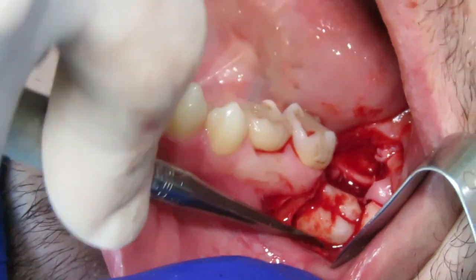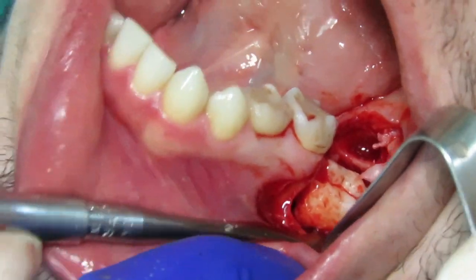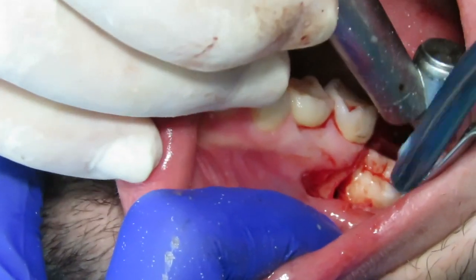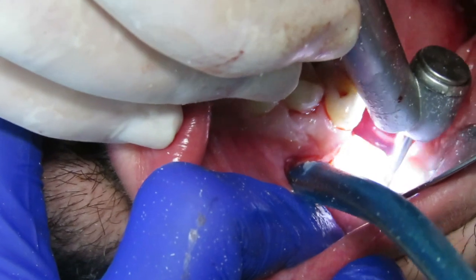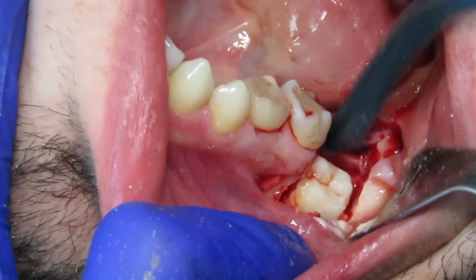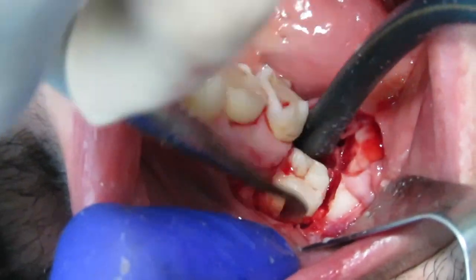Again, in that case, if the tooth was ankylosed, we would have most likely to separate the crown and do a coronectomy. But it was not necessary in that particular case. The tooth is now extracted.